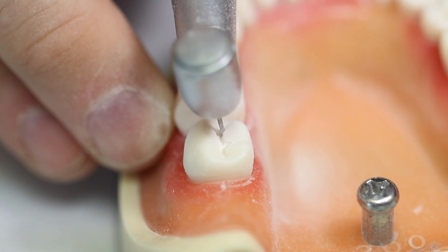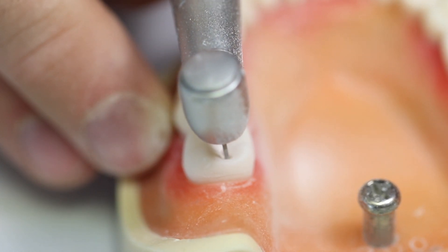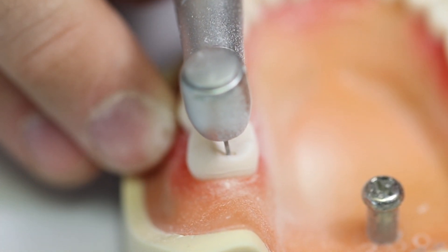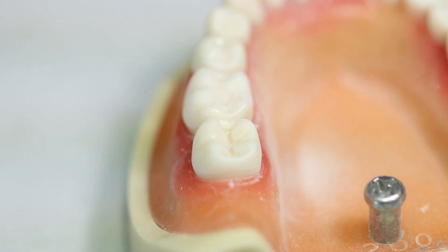Start following the lingual groove and the buccal groove, and maintain the integrity of the cusps by following around them and not flattening them. Blow off the dust with an air syringe when it becomes difficult to see.